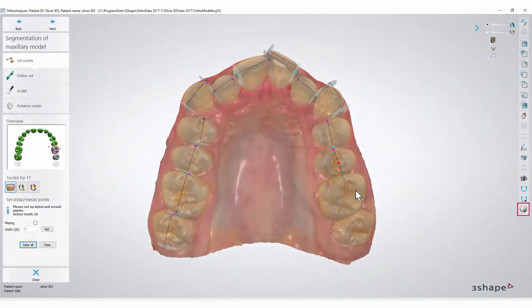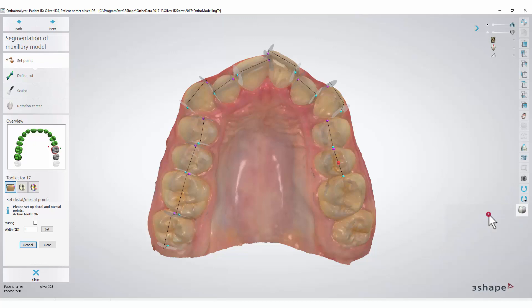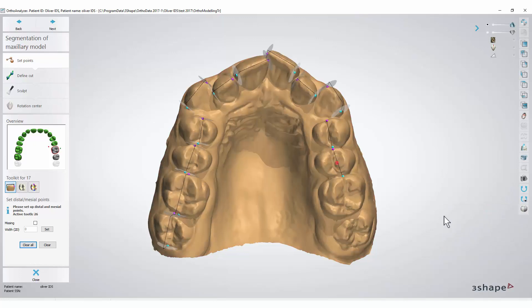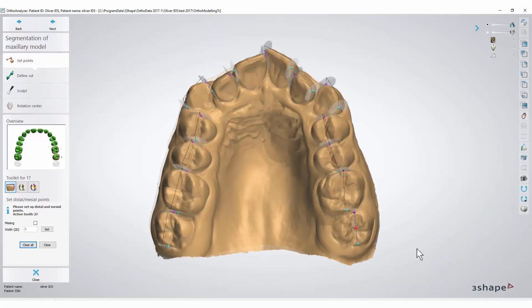If you prefer to see a model without texture, press the bottom-most button in the toolbar on the right side and disable the Show Scanner Acquired Texture option. Remember that you can always enable textures again.